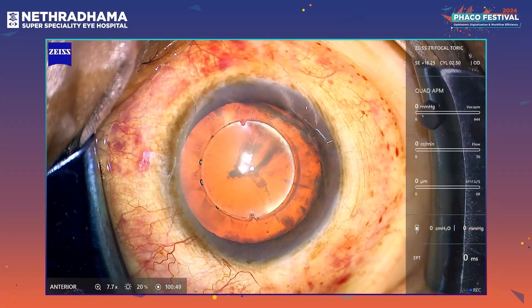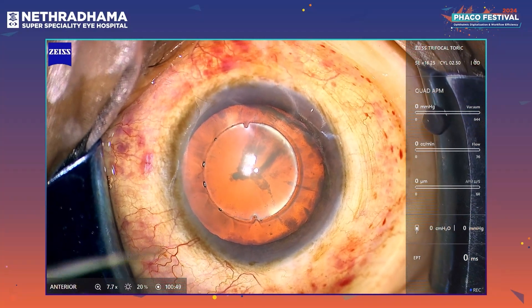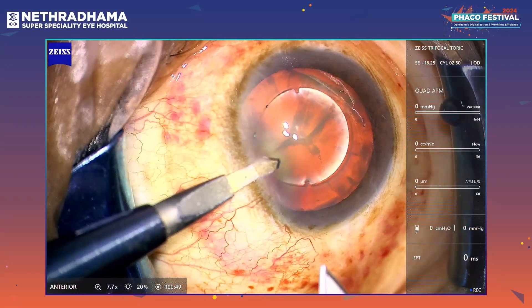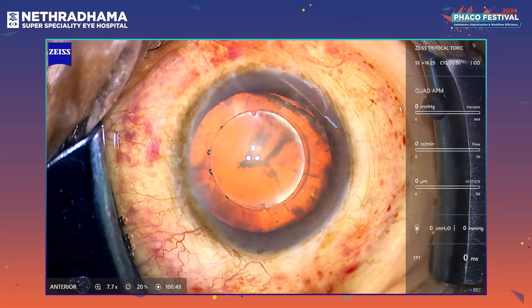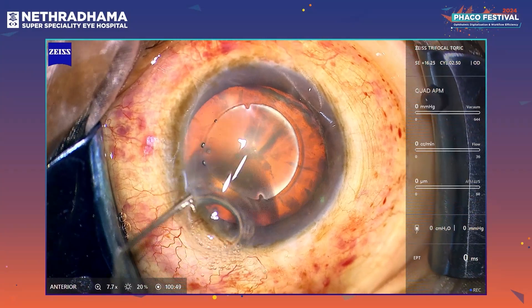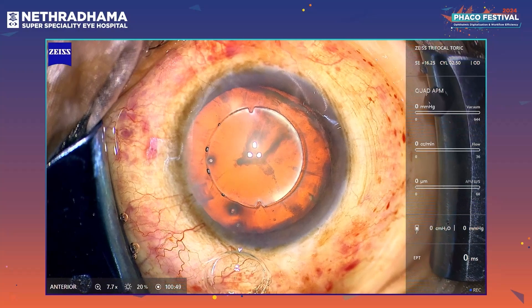This is a 72-year-old female and we are operating on the right eye. There is a grade 2 cataract. I am using the Quatera 700 machine today and the ATLISA trifocal toric IOL. There we go with the incisions — the femtocapsulotomy is already done. We always use intracameral xylocaine for topical cases.